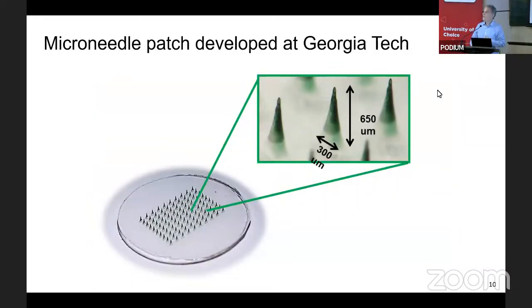And if you look closer still now, you can see these microneedles. You can see their dimensions. They measure hundreds of microns, so plenty long to get across that very thin stratum corneum barrier. The drug, in this case a green dye, is loaded selectively into the microneedle part of the device. You don't want the drug in the backing because that wouldn't be efficiently delivered. So we have a process to load selectively into the needles.